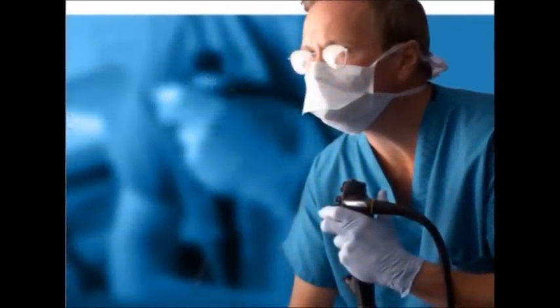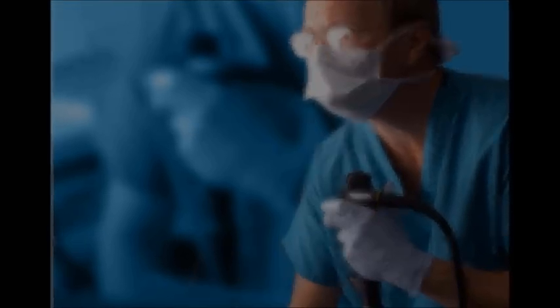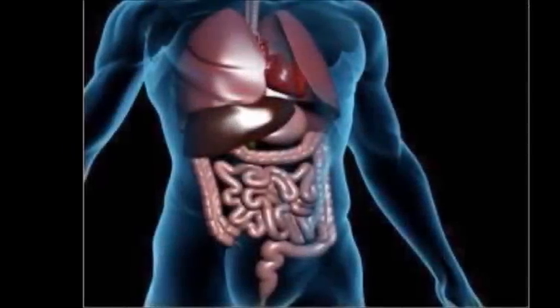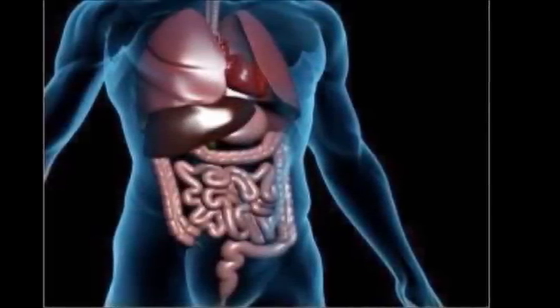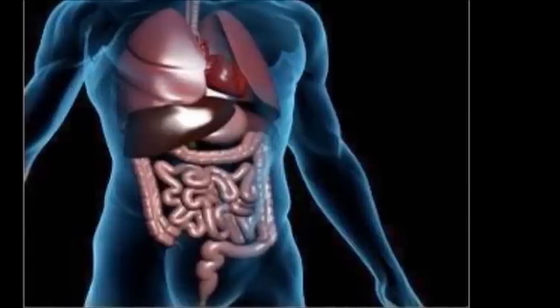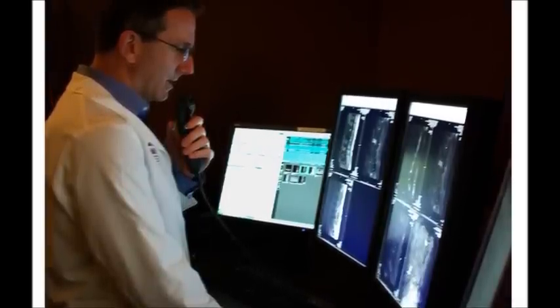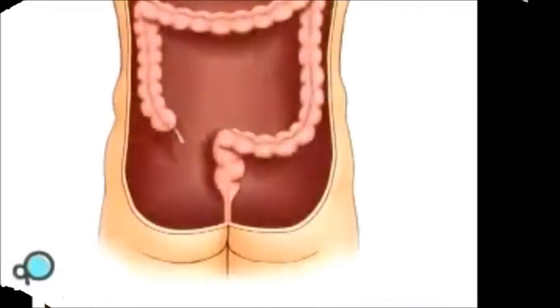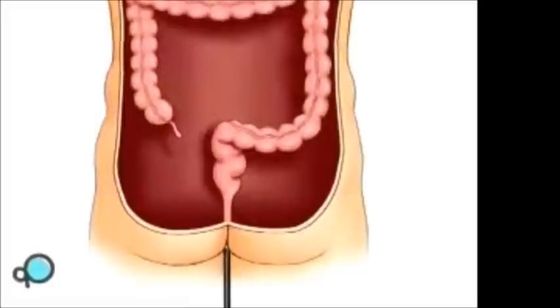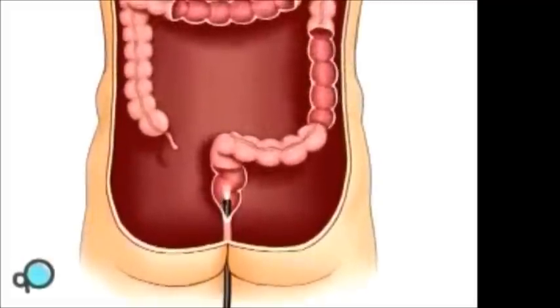Colonoscopy is a procedure that utilizes an endoscope for probing and diagnosis of gastrointestinal tract diseases, primarily in the colon. The colon is susceptible to diseases like colon cancer. Since the region is hard to reach and images from conventional imaging modalities are not as reliable or accurate, an endoscope is used due to its far-reaching capacities as well as its flexibility.